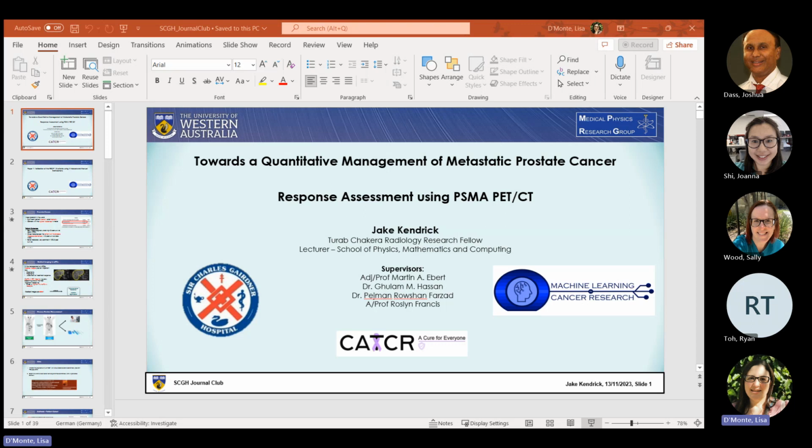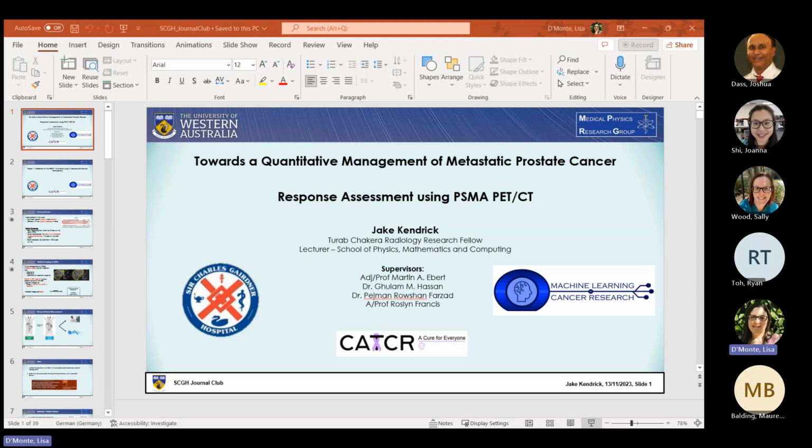Now, in a subset of these patients, 74, we used AI-based delineations to determine the tumour volume for both baseline and follow-up scans. This particular trained artificial intelligence model was one of the other papers I published as part of my PhD, and it was trained on the remainder of the patients, which is why we only tested this in a subset of the patients. So these 74 patients were the testing set that the model was never exposed to during the training process.